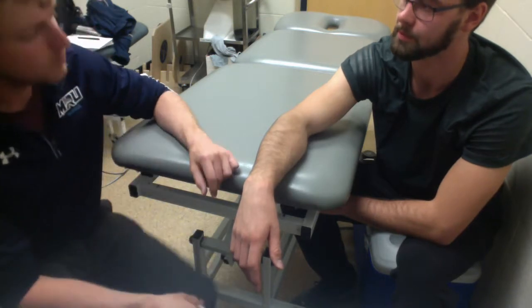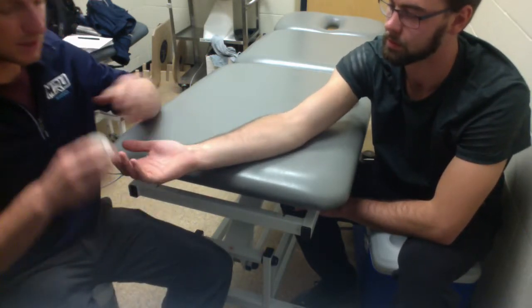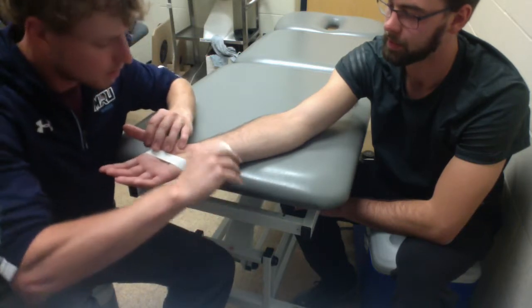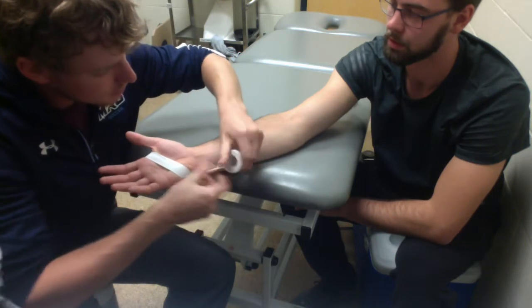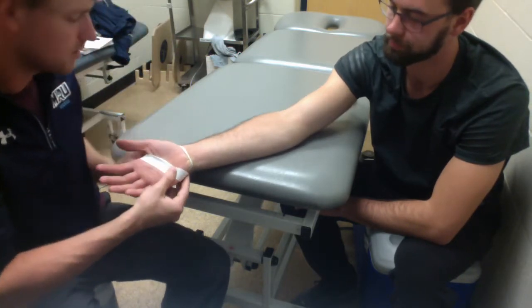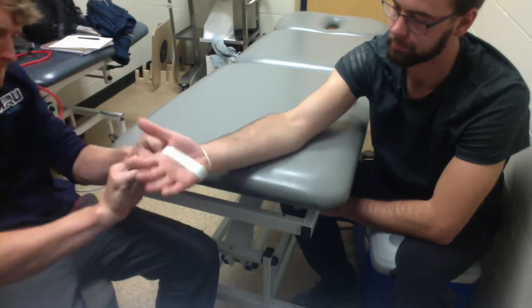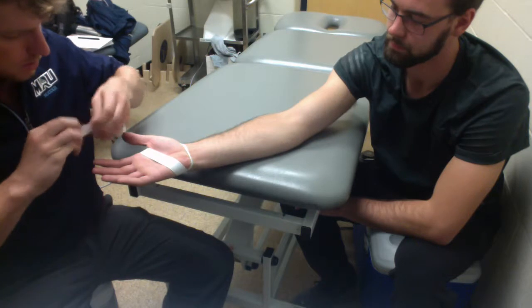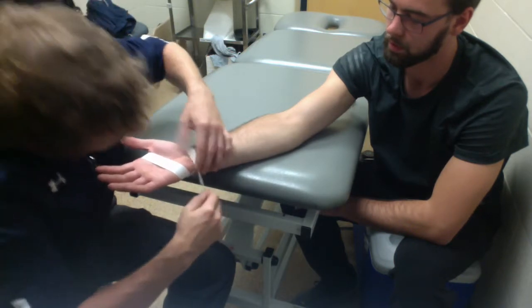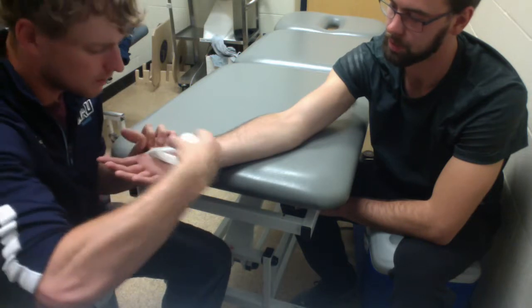Okay, Jordan. So before we move into our strength exercises, we're just going to tape your wrist into a bit of distraction. So I'll just get you with your palm facing up. Okay. I'm just going to put an anchor on here. And then just going to pull around. Is that all right? Yeah. Any pain there? No. You're getting a little bit of traction there? Yeah, it feels like some pressure on there. Yeah. Okay, good. And then I'll close that out. I'm just going to come across the other way. I'm not cutting into your thumb here. Nope. Good. Lots of movement there. Yeah. Okay.